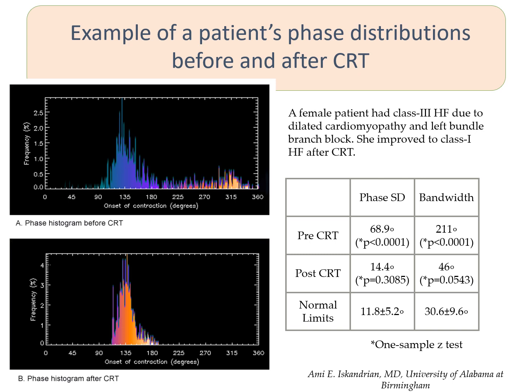Now, in patients that truly need to be resynchronized, like this patient here, first of all, note how wide this phase histogram distribution is, compared to the previous patient or the normal patient. So this standard deviation is about 69. When this is done successfully, the results are remarkable. And note that this patient went from very, very abnormal dyssynchrony to almost normal synchronicity.